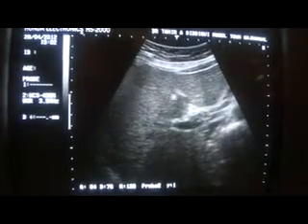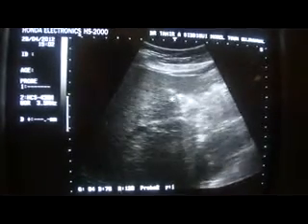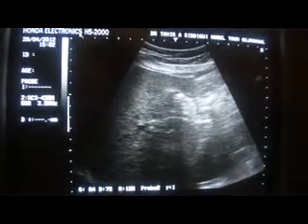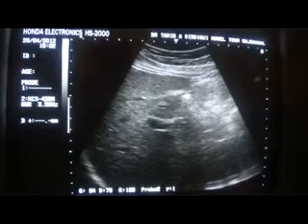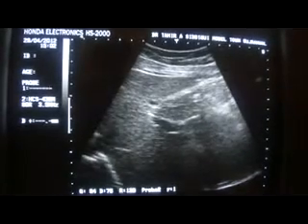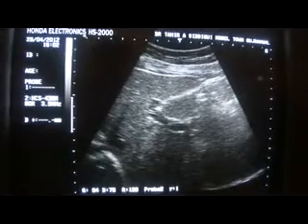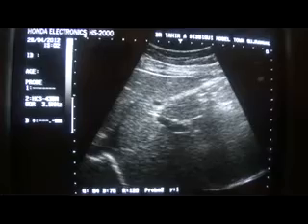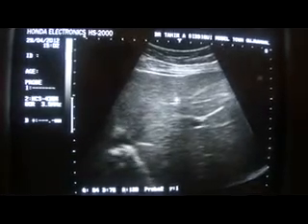As you go up and move the probe, angle the probe a bit, then you see the ligamentum venosum. You have seen three ligaments and one median lobar fissure in this video segment. These are important landmarks one should be well acquainted with.